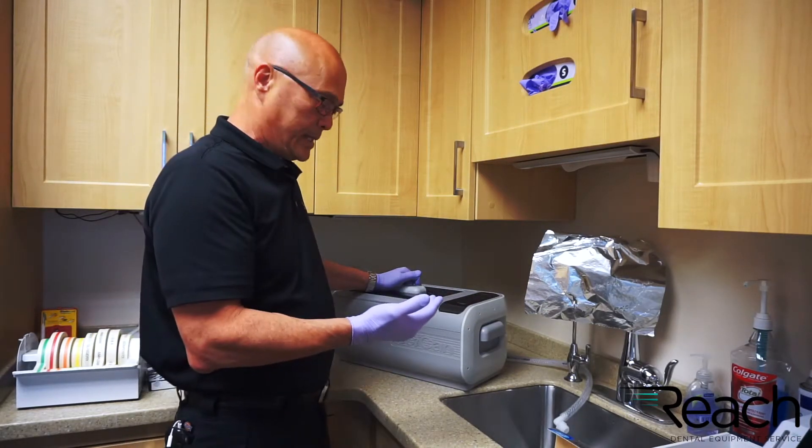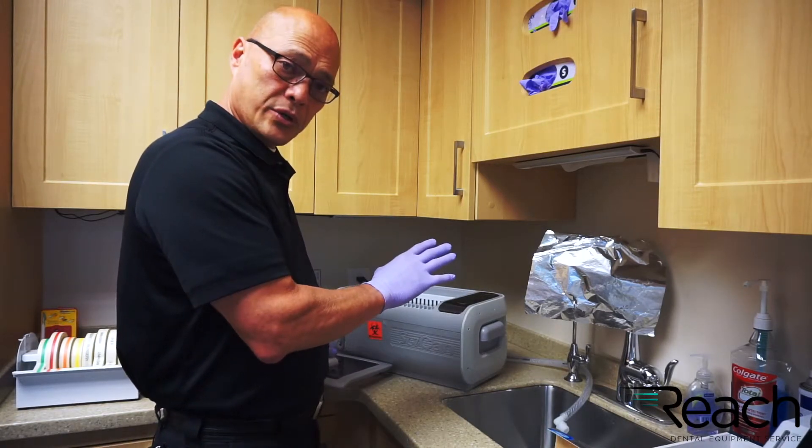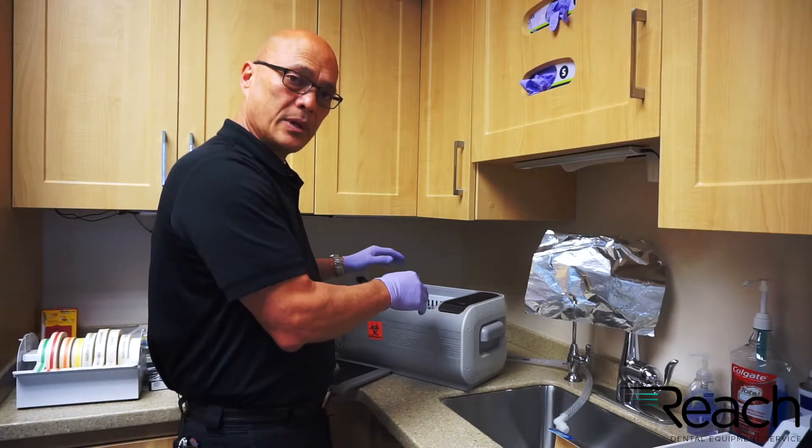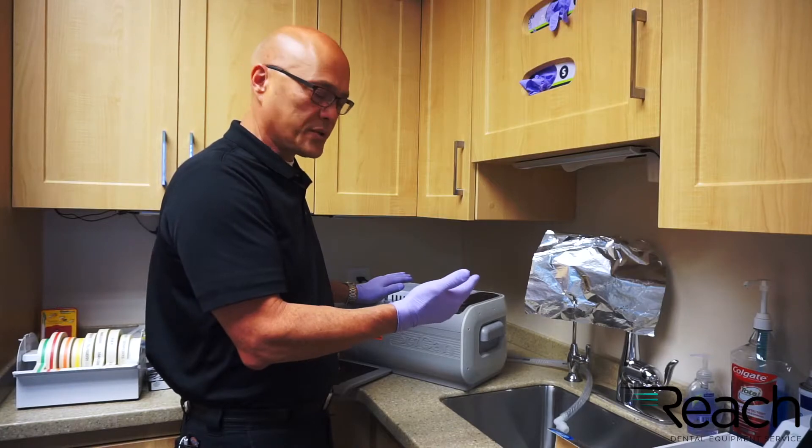Now maintenance — maintenance is pretty easy. Also, when you are running this, you never want to run it without your detergent mixed in the water. There are a lot of different manufacturers for that, so follow those recommendations from that manufacturer as well.